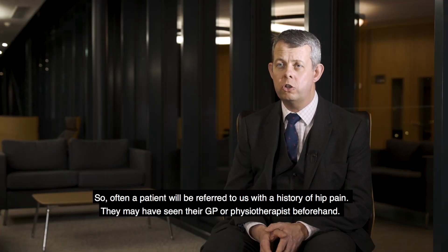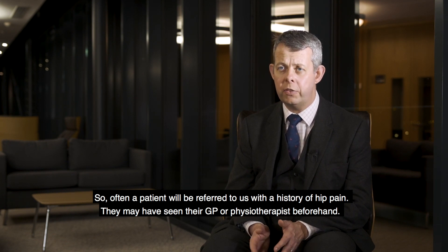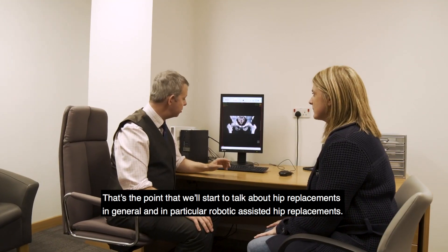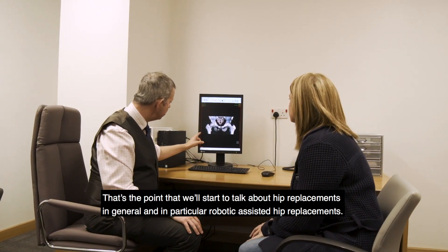Often a patient will be referred to us with a history of hip pain. They may have seen their GP or their physiotherapist beforehand. That's the point where we'll start to talk about hip replacements in general and in particular about robotic assisted hip replacements.